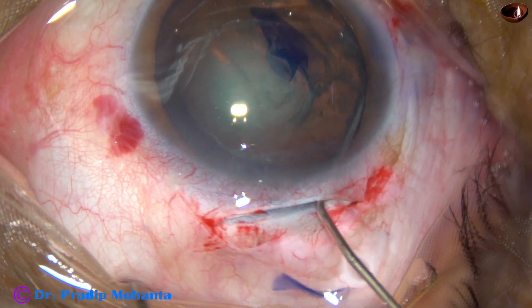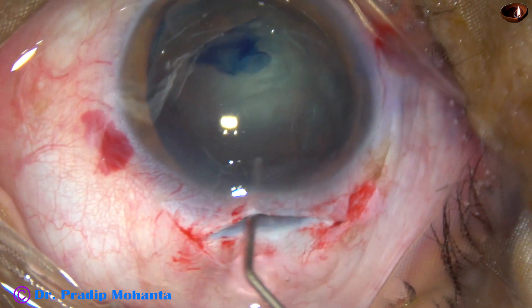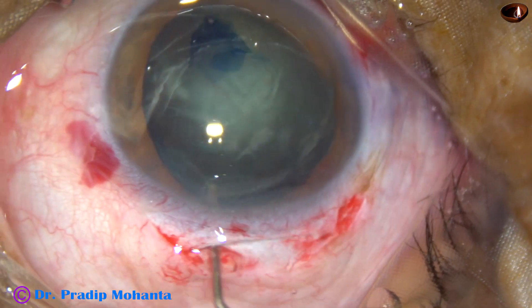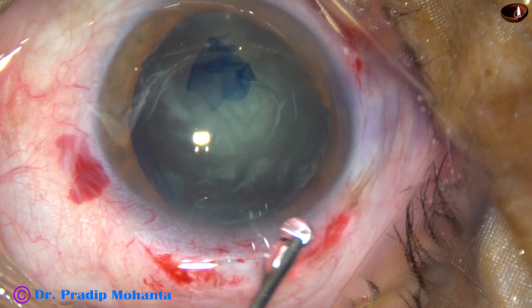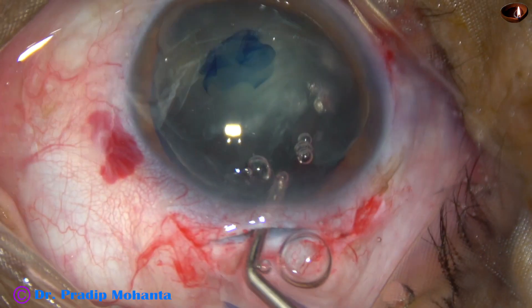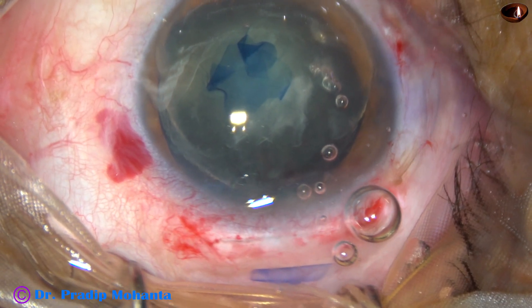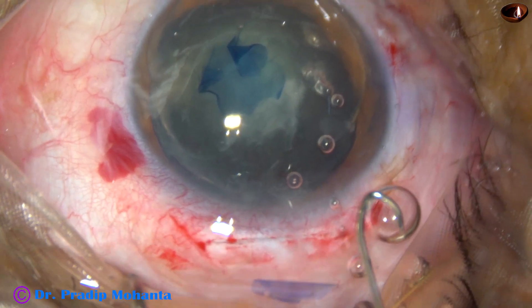Now let us see if the nucleus prolapses by hydrodissection only. When the rhexis is adequate, most of the time the nucleus will prolapse by hydrodissection only. Now this is 2% HPMC again injected. The nucleus has been prolapsed into the anterior chamber and now the nucleus is to be delivered.